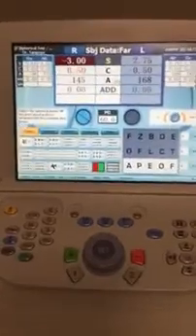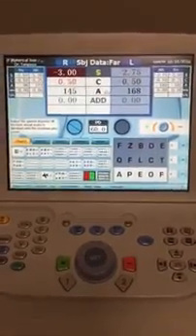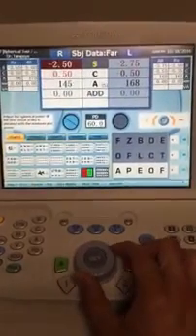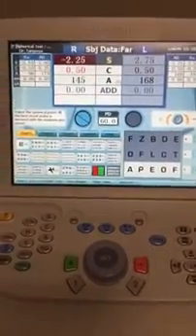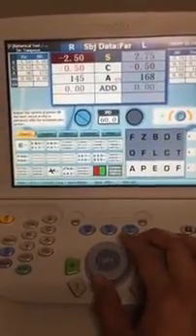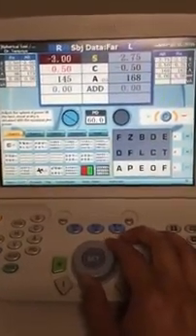It is your decision. I guess it depends on how you like to refract. I typically like to fog at this point, so I will go in the plus direction. I'll turn the knob in the plus direction by plus 75, and I will say, stop when you can read those letters, and say that they can see those letters right there.